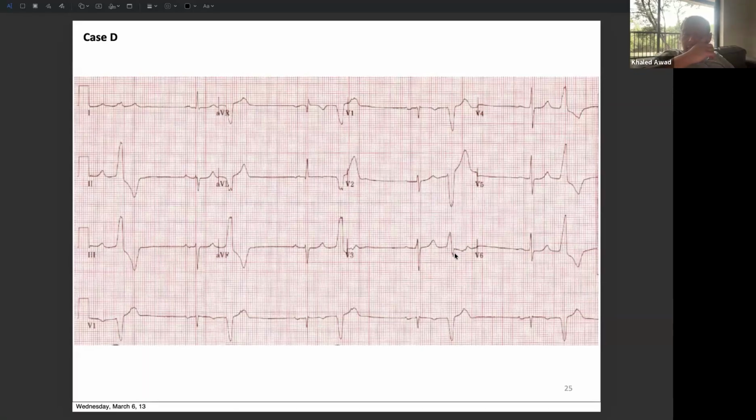You see that happens before sinus rhythm. Sinus rhythm transitions in V4, V5. And so we said V3 transition, if it happens before sinus, then probably 70% of the time we're dealing with something coming from the LVOT.